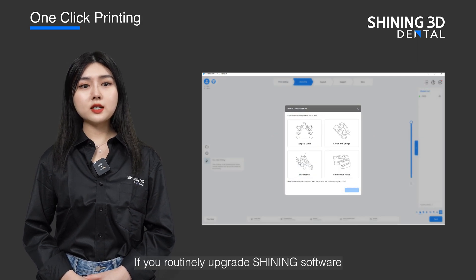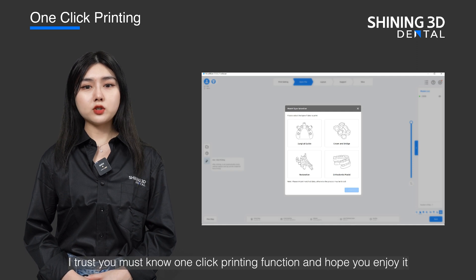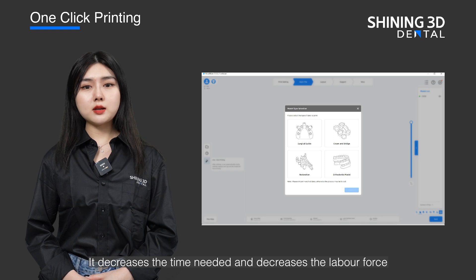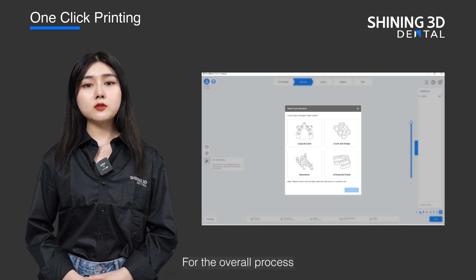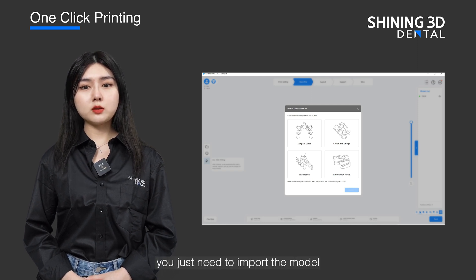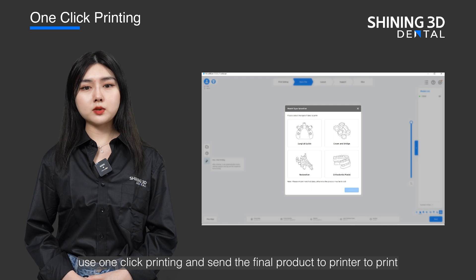If you routinely upgrade Shining software, I trust you must know the one-click printing function and I hope you enjoy it. It decreases the time needed and the labor force needed to lay out, add support, and slice. For the overall process you just need to import the model, use one-click printing, and send the final product to the printer to print.